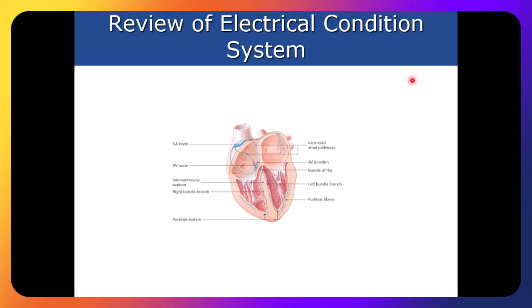Okay, so now we're picking up on something. No P wave, but my QRSs are all over the place. I'm beginning to think that may be AFib. But if I look at the next one, it's no P wave, but boy, look how regular those QRSs are. Now I'm thinking maybe I've got a junctional rhythm going on here for this particular patient.